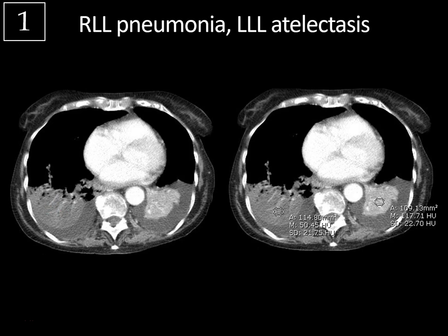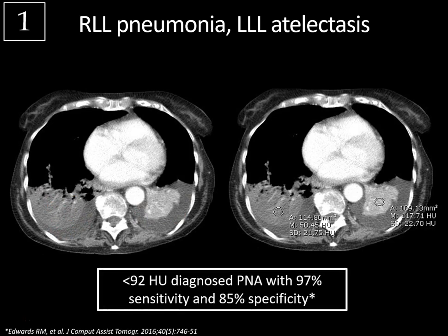Notice how with the atelectatic lung there's volume loss — you can see that lung has collapsed. The lobe is very small and it's surrounded by this effusion, whereas with the consolidated lung filled with pneumonia, it's just floating on top of the effusion; it's taking up space and you don't see any volume loss. There's actually a nice study by Edwards et al. that showed a threshold of 92 Hounsfield units diagnosed pneumonia with 97% sensitivity and 85% specificity.